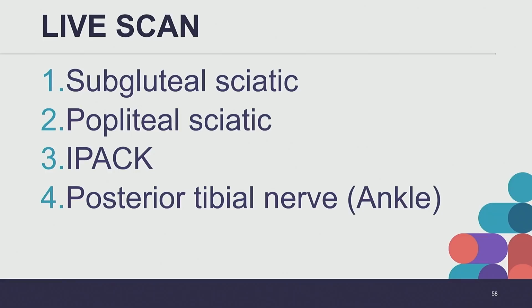Okay, and then we'll shift gears to the popliteal sciatic nerve block. Okay, and just as I visualize the 2 nerves in the popliteal fossa with the curvilinear probe, I'm now going to switch to the linear probe. Put it in basically the same exact position, and you can tell there's a nerve structure right on top. This is where fanning the probe back and forth and really getting the nerve to highlight itself is helpful.